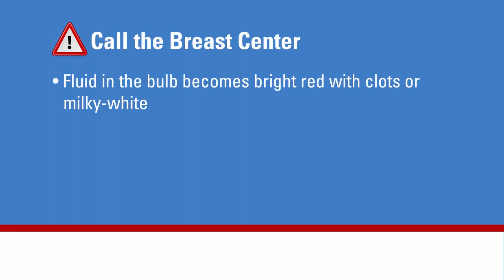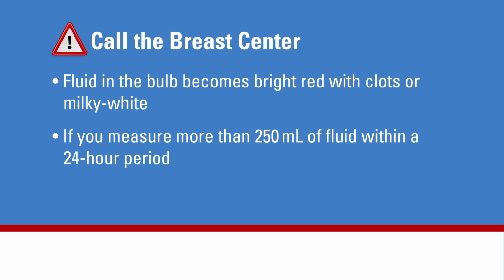Call the breast center right away if the fluid in your bulb becomes bright red with clots or milky white in color. Also, call the breast center right away if you measure more than 250 milliliters of fluid within a 24-hour period.